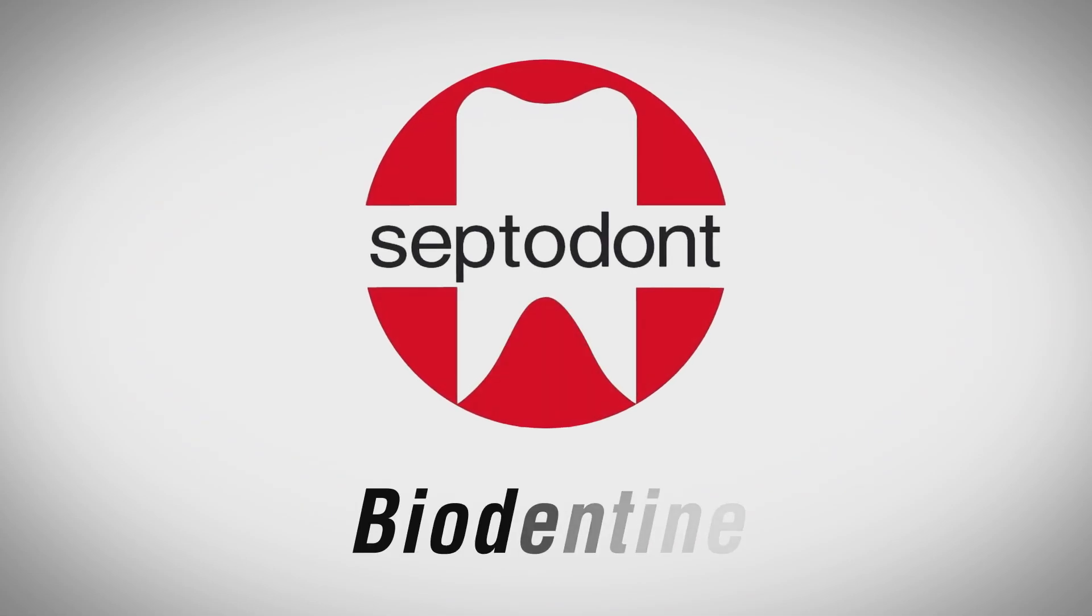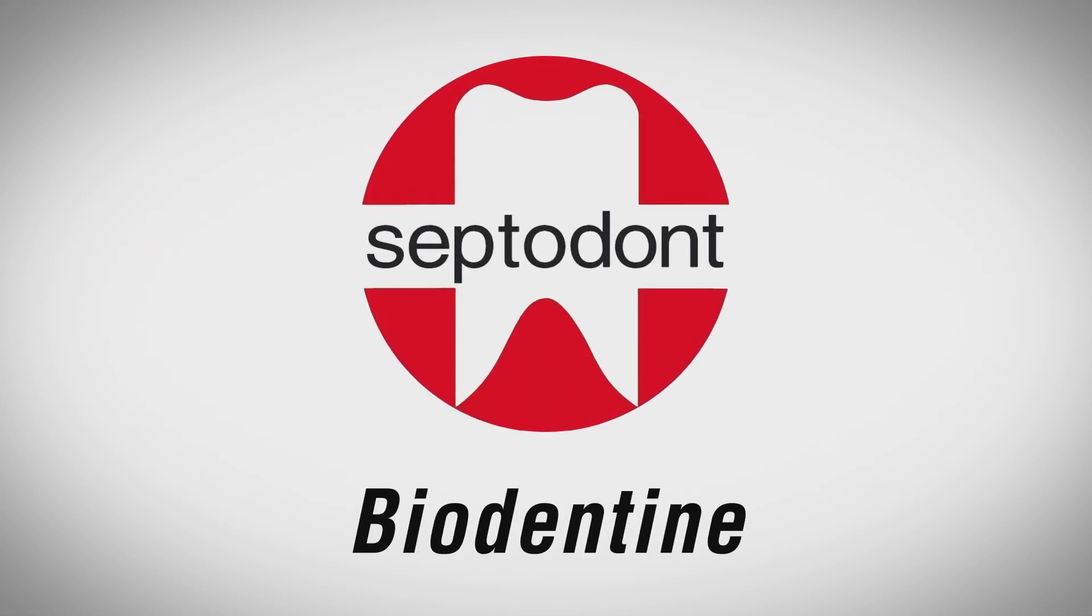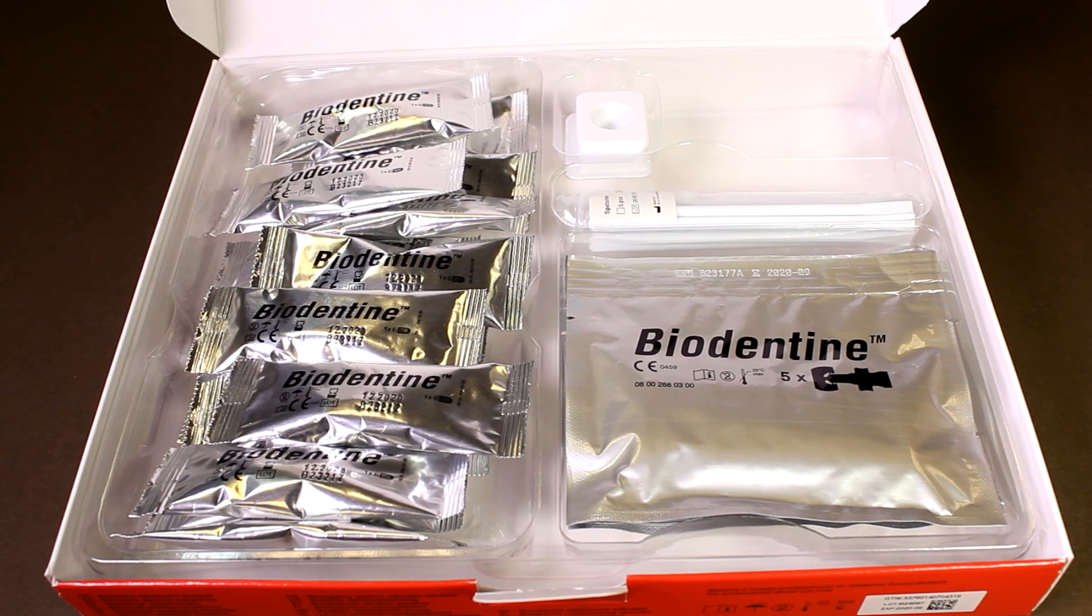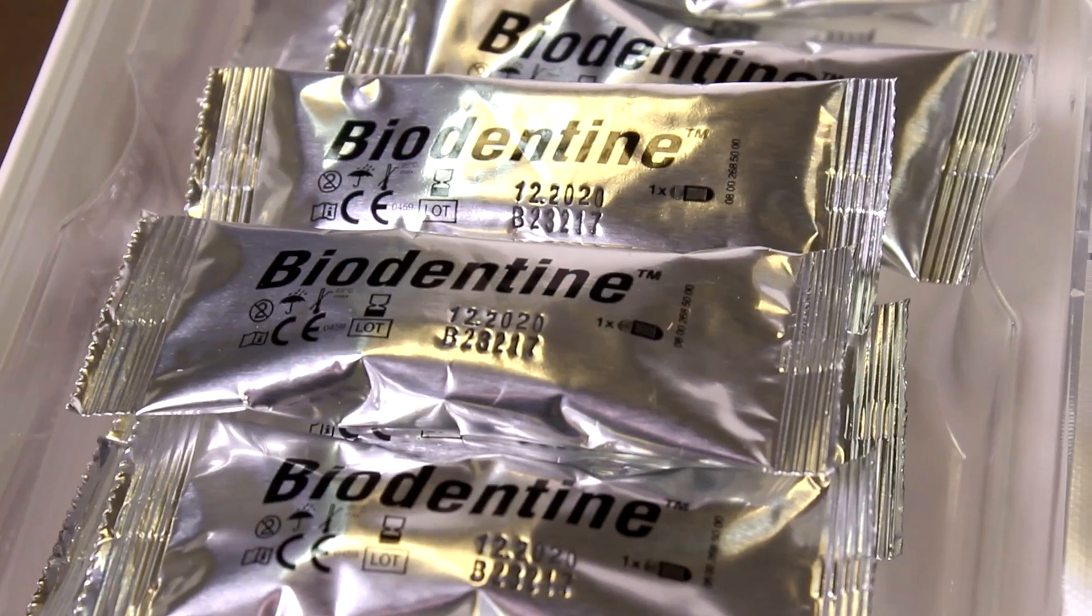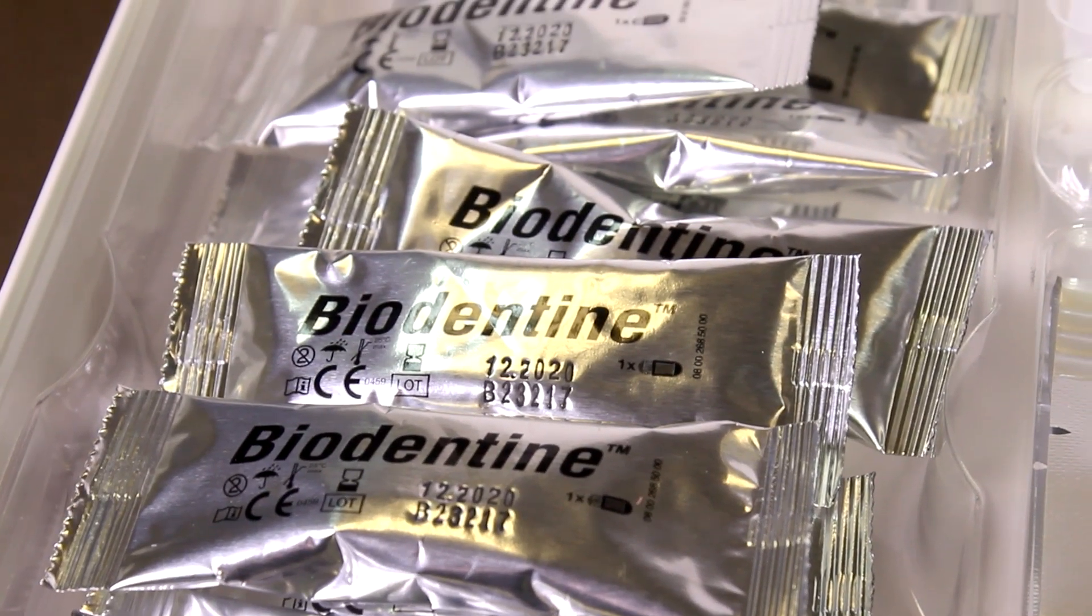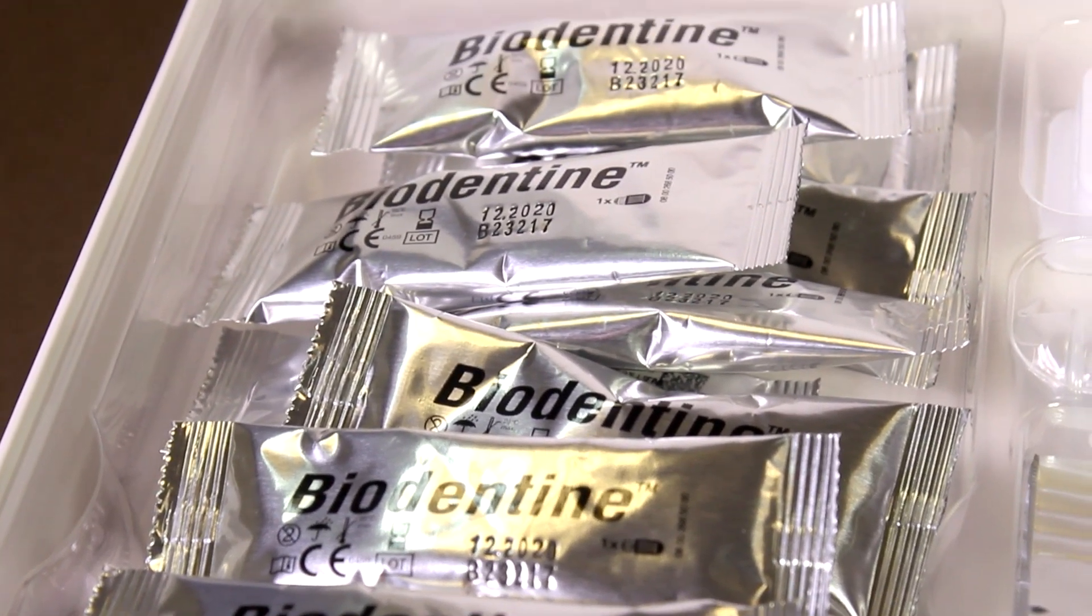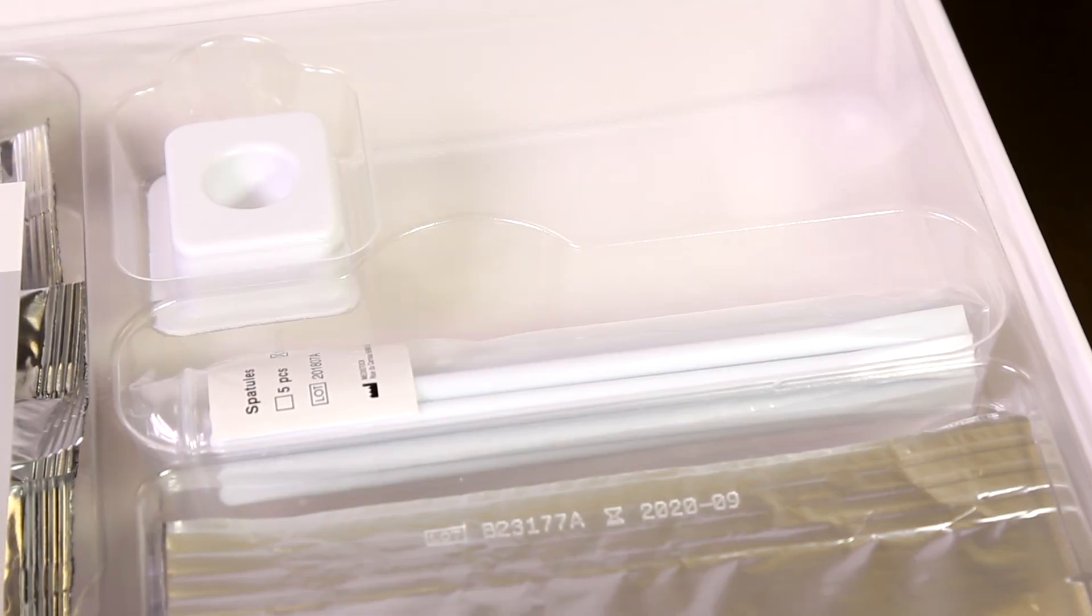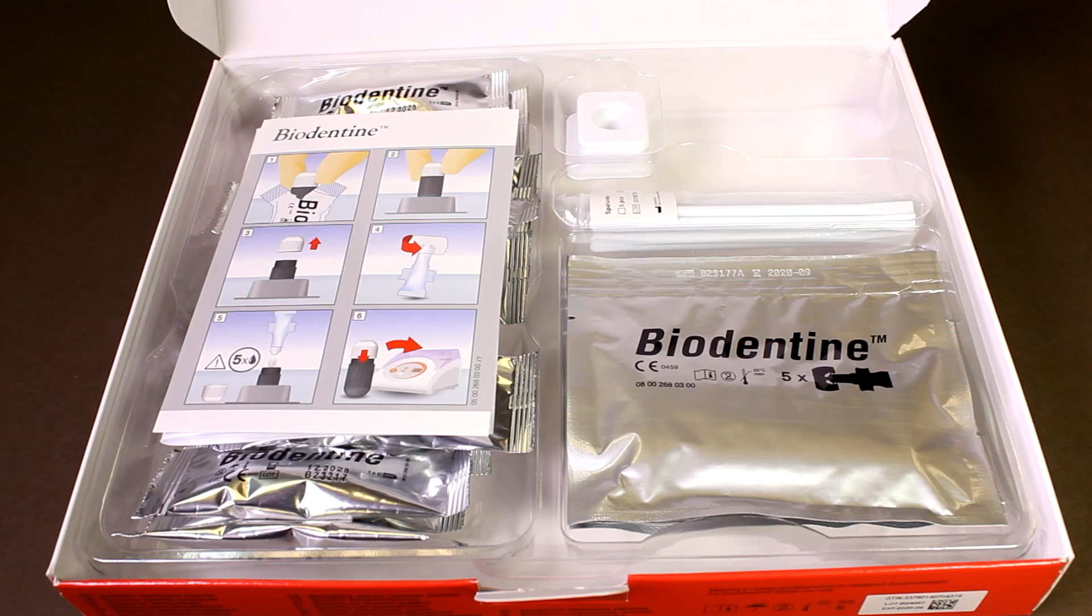Biodentine, brought to you by Septodont. Inside a box of Biodentine there are 15 capsules, each containing 0.7 grams of powder, 15 filled pipettes, a capsule stand, 15 spatulas and a laminated instruction leaflet.